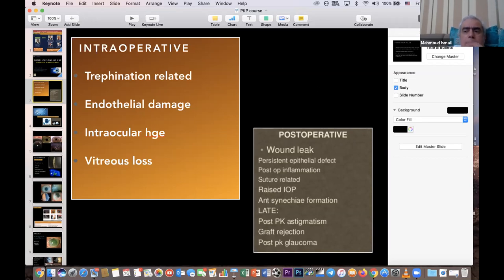Centralize, and the punching should be done with one full pressure, one strike. Pressure all through. Don't try to make a zigzag application on the back of the cornea. Otherwise, you have trimmed the Descemet's membrane, and this might lead later on to some kind of tiny, microscopic Descemet's detachment, which will damage the endothelium later in the patient's eye.